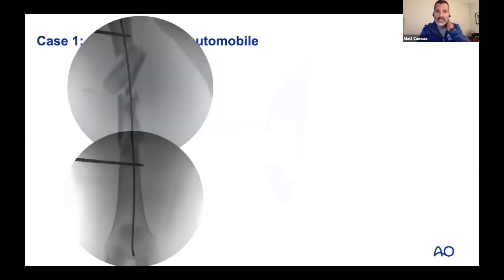Now I look critically in the segment of the bone that doesn't have an isthmus. And so in this case, I would argue that the proximal segment still sort of has an isthmus, but distally, it's become wider than what my nail is going to be able to come in contact with. And so when I look at my guide rod there, the guide rod happens to be somewhat medial in its trajectory.